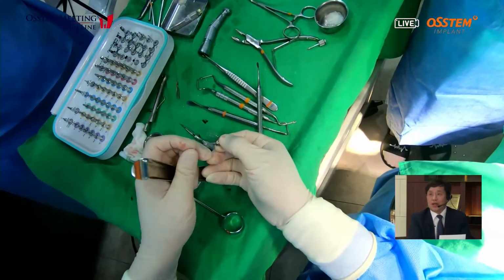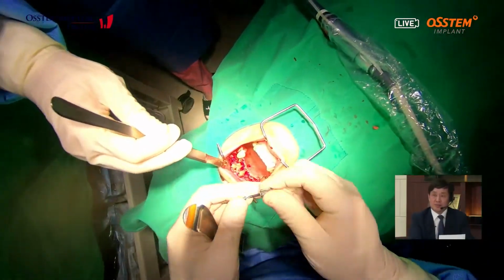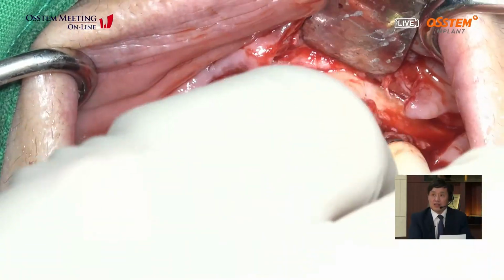What millimeter of the anchor height? 3.0, yeah, because I planned deep placement. Yeah. He connected the anchor. The height is 3 millimeters.